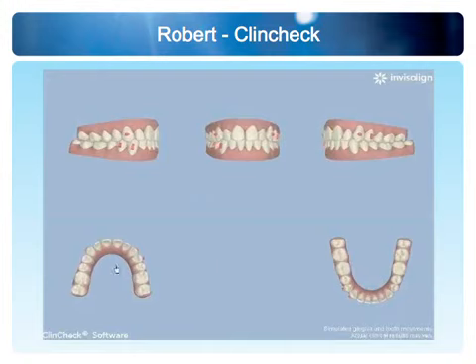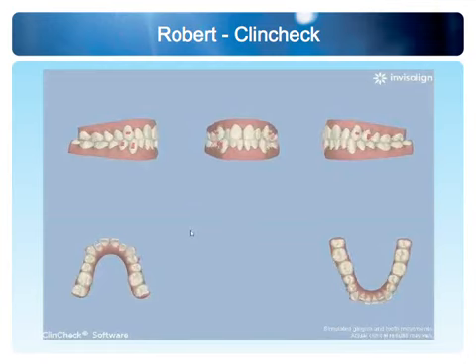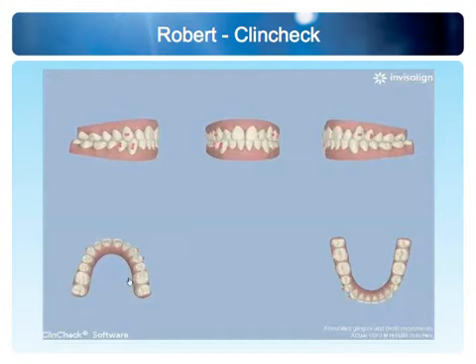And this case had about 2 millimeters of IPR in each arch, but in the posterior. I keep it in the canine and premolar areas. I'm just happier to do posterior IPR than anterior.